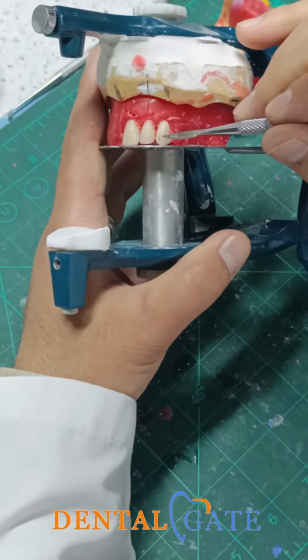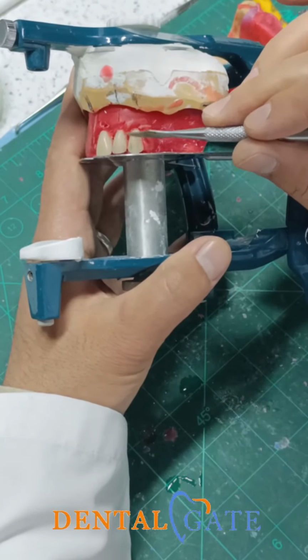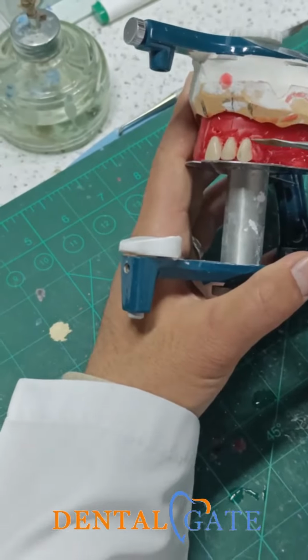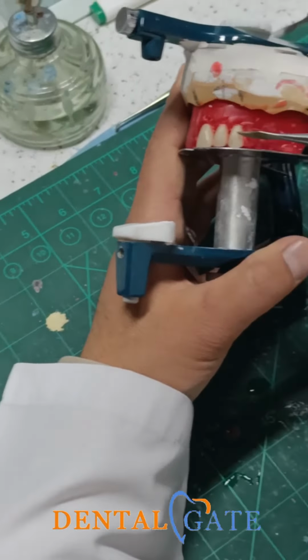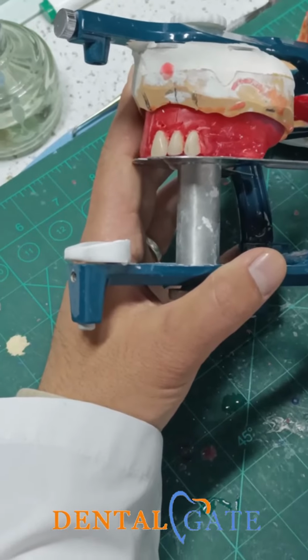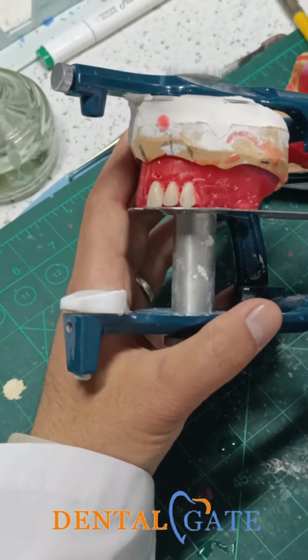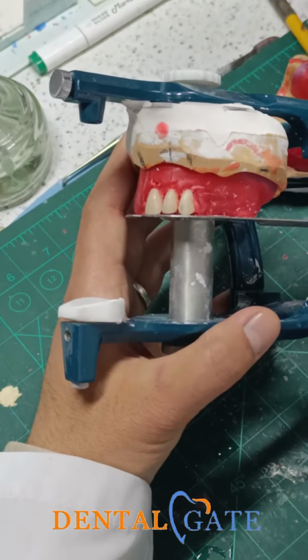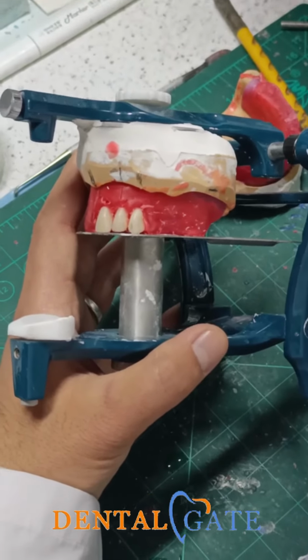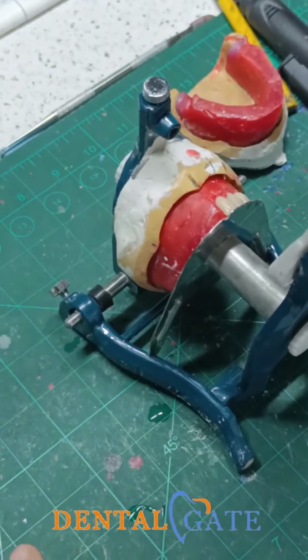So regarding the canine, we have the labial ridge, we have inclination, we have a prominent area. The most convexity in the canine will be located in the middle portion. So that's what we say. We just put the canine in the normal position, and the anatomical landmarks will be assessed to perform these criteria. So I will start on the other side.